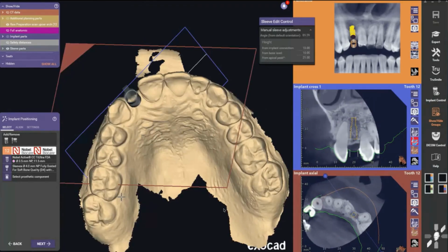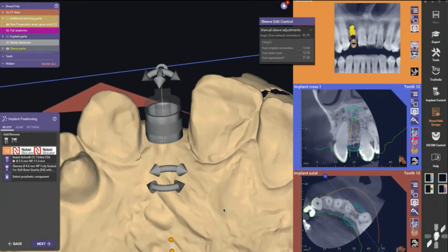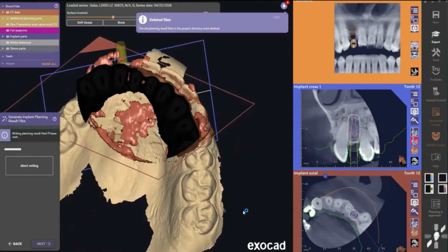Right. So once we've done our position, we work through the reslice curves, we have a look at everything in the position of the implants, then we send you the plan. So once you've received that plan, you'll have a look. And again, it's a PDF. We also do quite often, we do live reviews. So we can then go and do a web meeting just like today on your case, and then we can review it. But in this particular case, the patient had a pretty good opening as far as the lateral position. There was lots of room. We were able to fit everything in, but we'll generate the implant plan for you.